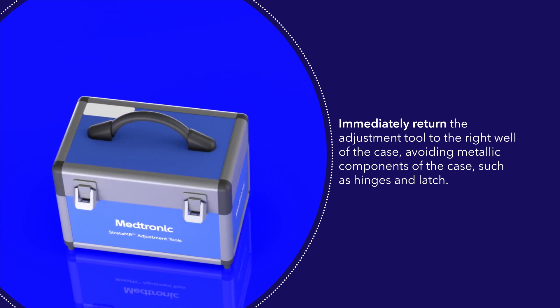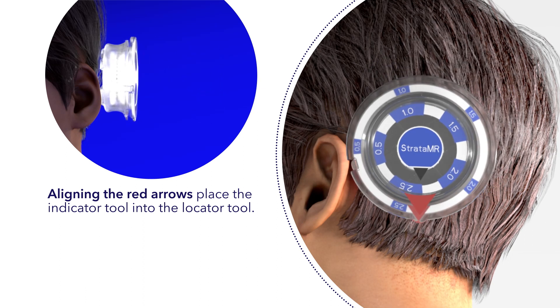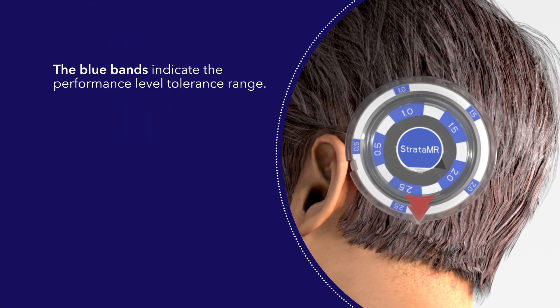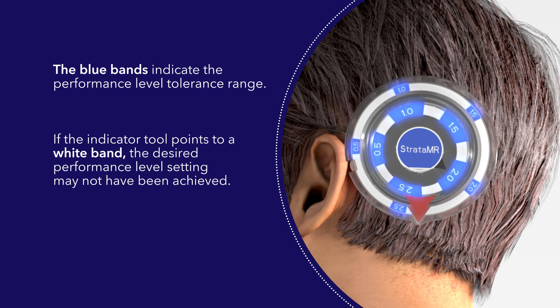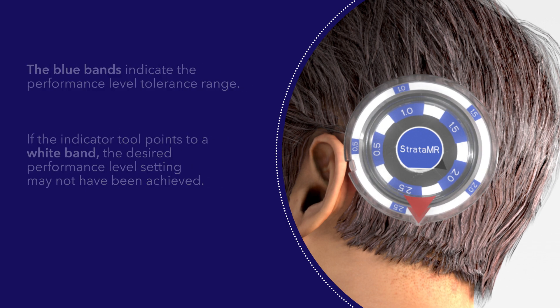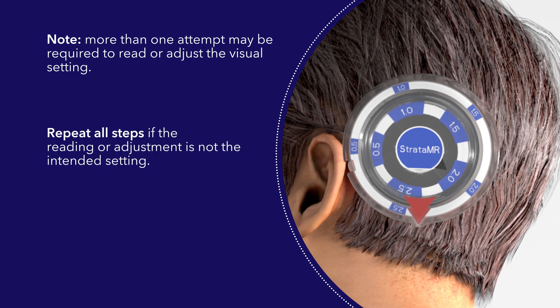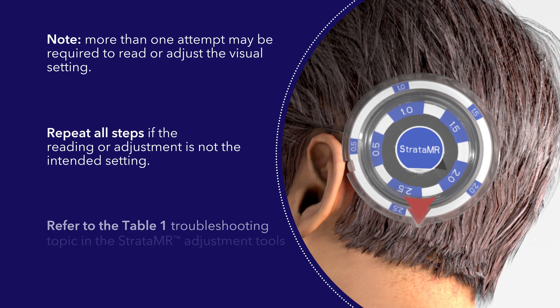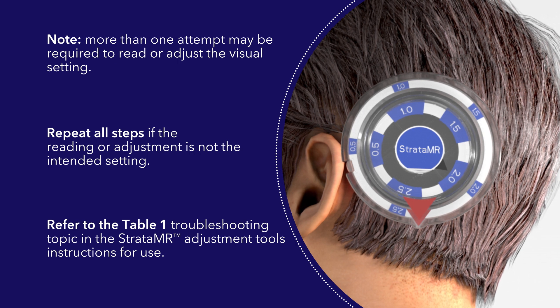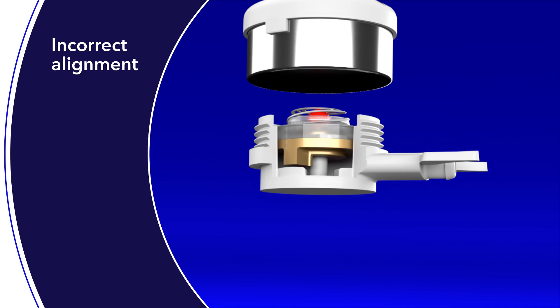Aligning the red arrows, place the indicator tool into the locator tool. The indicator tool pointer will now point to the valve's performance level setting. The blue bands indicate the performance level tolerance range. If the indicator tool points to a white band, the desired performance level setting may not have been achieved. Note: more than one attempt may be required to read or adjust the visual setting. Repeat all steps if the reading or adjustment is not the intended setting. Refer to the troubleshooting topic in the Strata MR adjustment tools instructions for use.